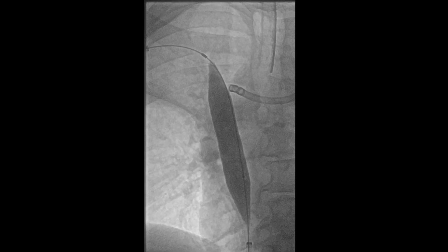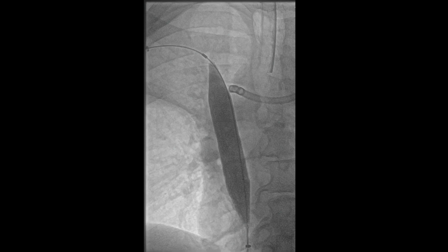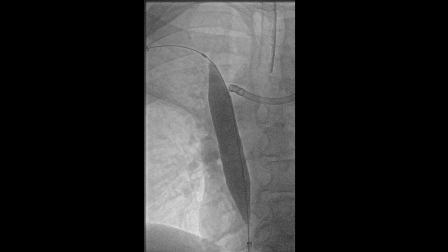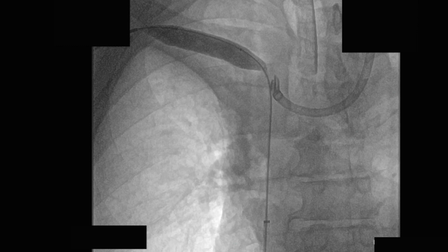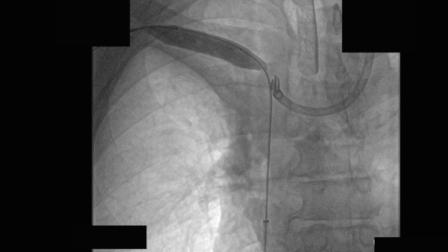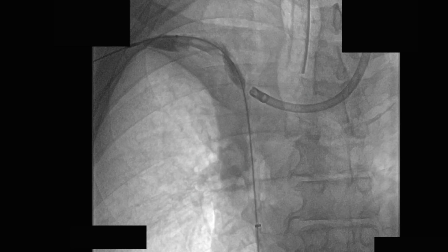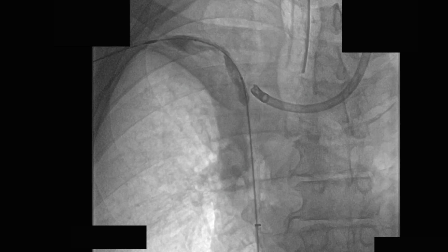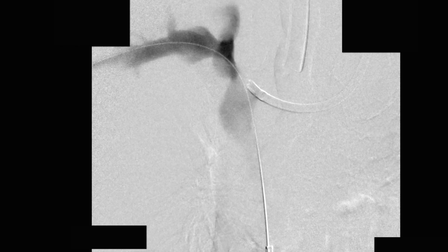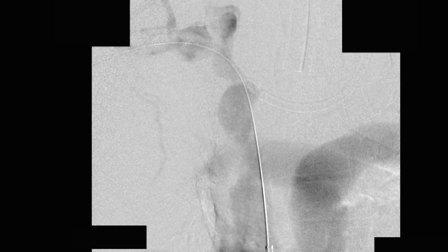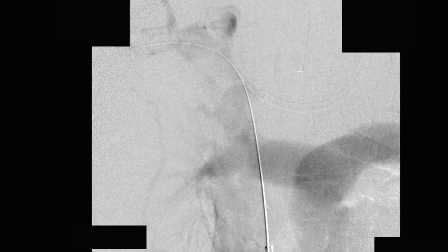Here you see the 16-millimeter balloon used for the angioplasty of the superior vena cava. Then, based on the initial venogram, we used a 12-millimeter balloon and performed angioplasty into the right brachiocephalic and right subclavian veins, as you see here.